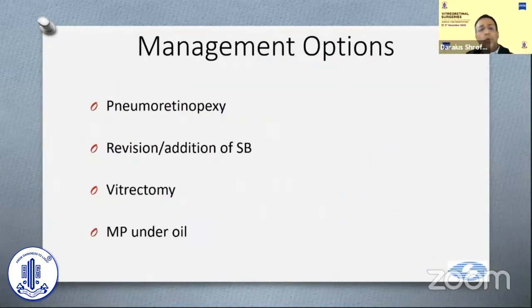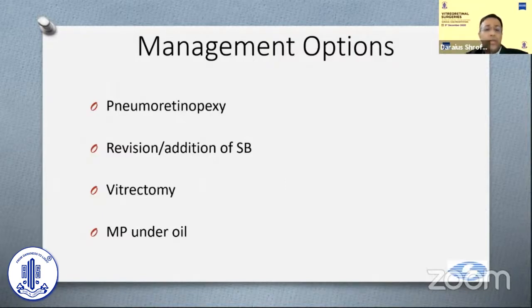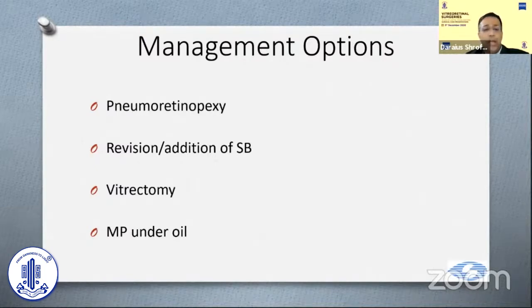How do we manage this? You can inject gas as a pneumatic retinopexy, revise or add a scleral buckle, do a vitrectomy, or do membrane peeling under oil. I'll be showing surgical videos of all these steps.